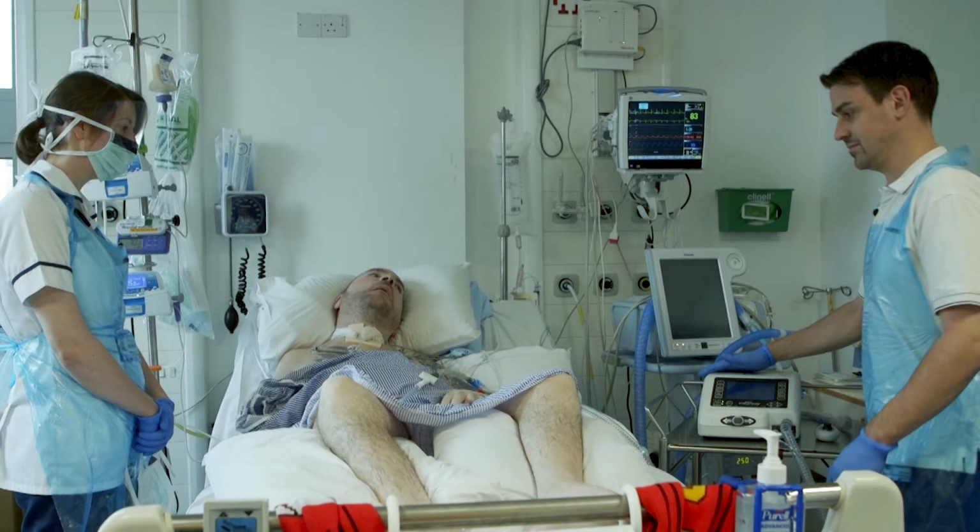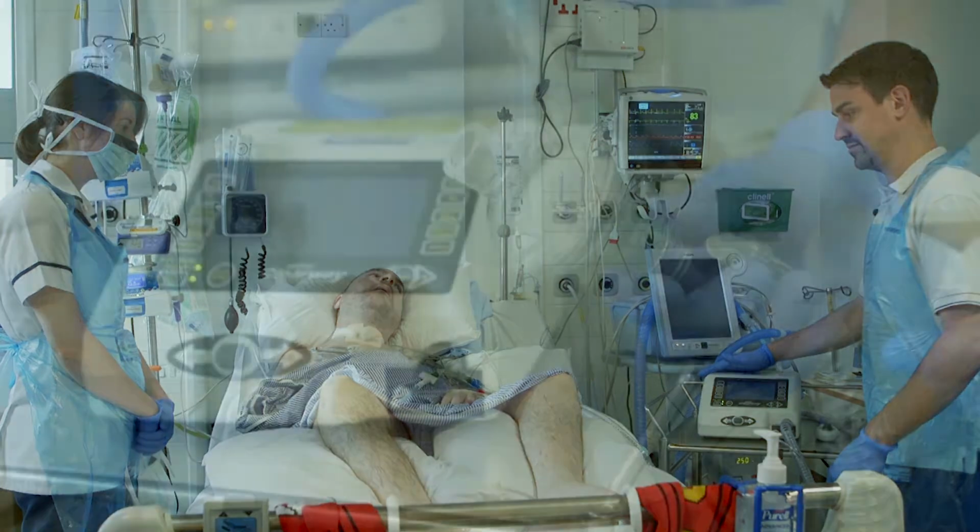These treatments are indicated in the patient as they are recovering from a chest infection post complications after surgery for deep brain stimulation. He has a background of spinal cord injury from an accident 20 years ago and therefore requires daily chest physio to help manage his secretions.